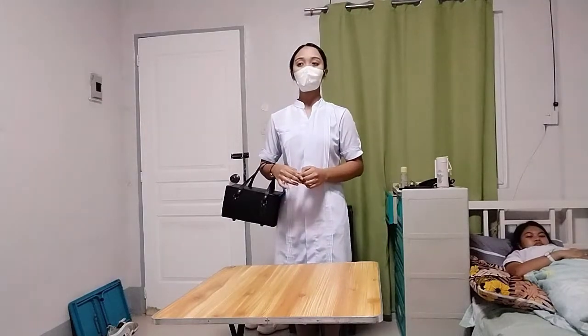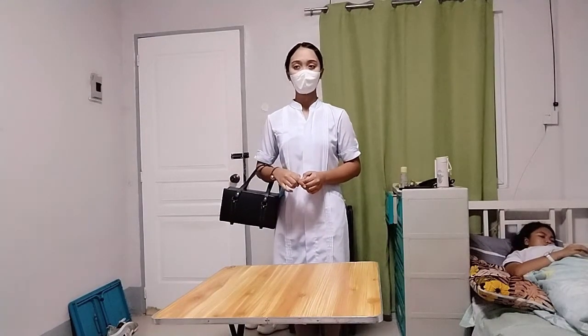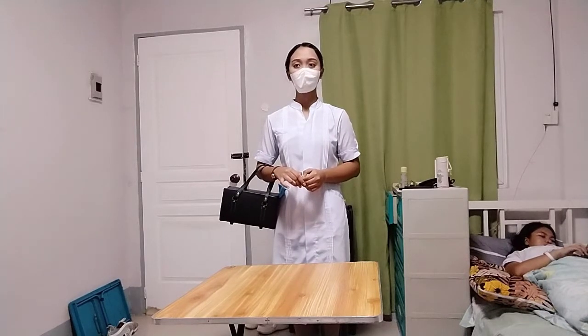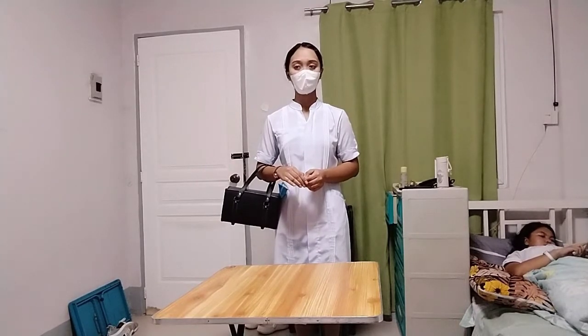For the evaluation, we assess and evaluate the comfort of the client after the nursing care. Transport the specimen to the laboratory immediately. If immediate transport is not possible, check with laboratory personnel or the policy manual whether refrigeration is contraindicated.